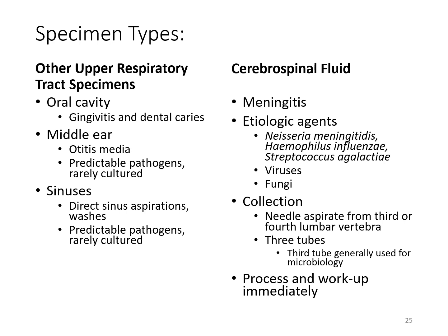For a sinus infection, you could potentially get some sort of direct sinus aspiration or wash. This helps to locate any particular pathogens. It's not often that you'll do cultures for sinuses, but it might be a situation where an infection isn't resolving, or they think there's some kind of fungus ball located in there, so fungal cultures may be ordered. So occasionally you could see cultures for sinuses. CSF, or cerebrospinal fluid: we're looking for something that could potentially be causing meningitis.